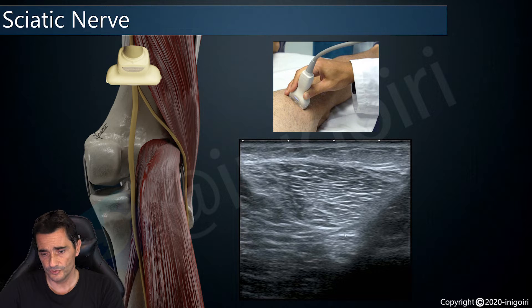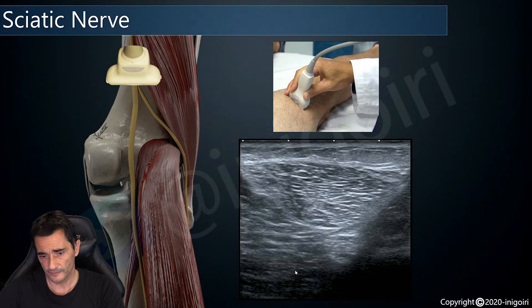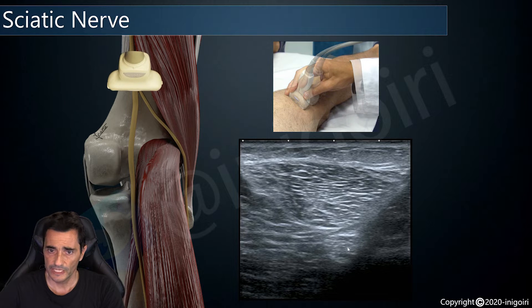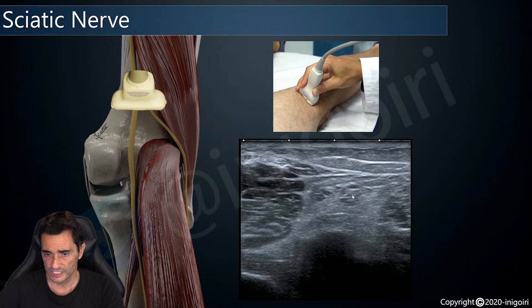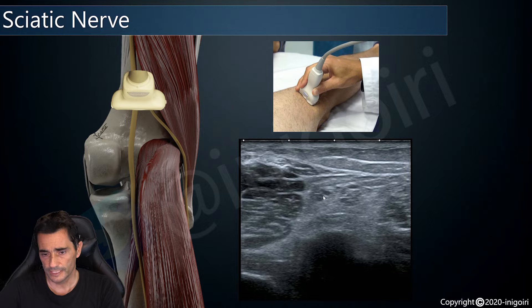We will find the sciatic nerve as a unique nerve located just underneath the long head of the biceps. This is the short head of the biceps, and at this level, just underneath this muscle, we will find the sciatic nerve. As we continue distally, we notice how the sciatic nerve becomes superficial and divides into its branches: the tibial nerve, bigger and medial, and the common peroneal nerve, smaller and lateral.